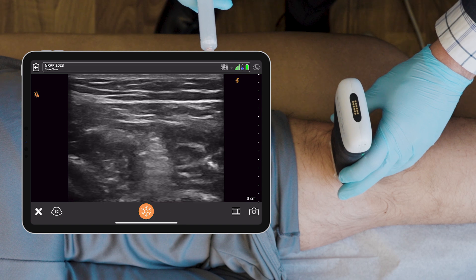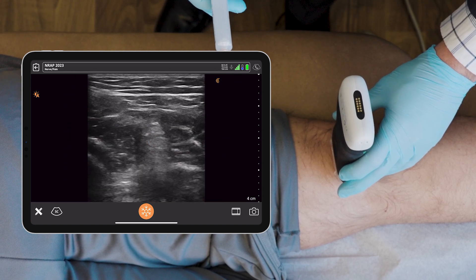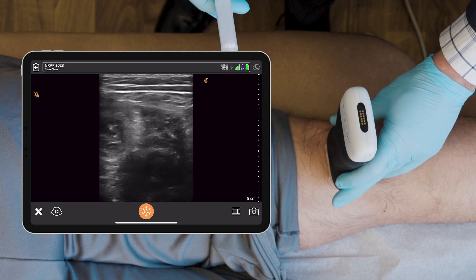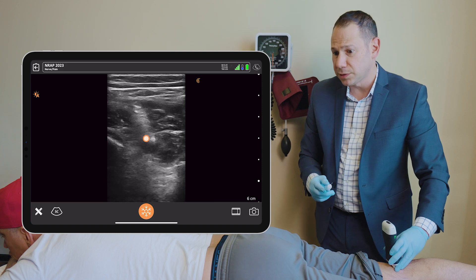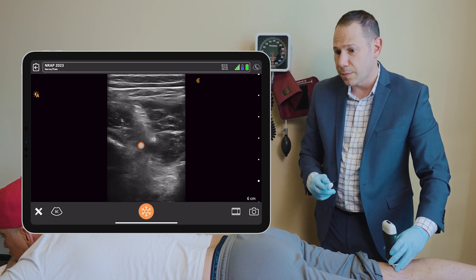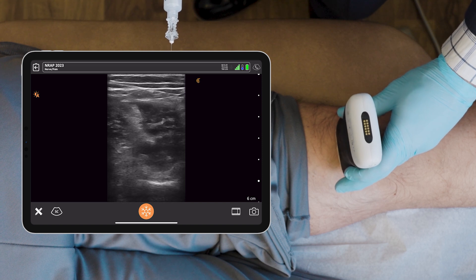Here we see the tibial nerve. Increasing depth. We can see the pulsatile blood vessel, and I'm going to go deep to the blood vessel to get the region of his pain behind the joint.